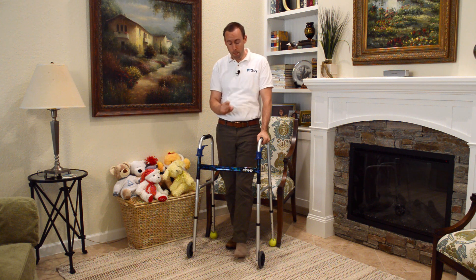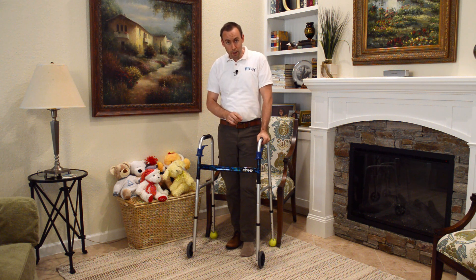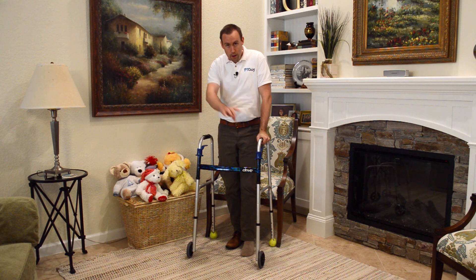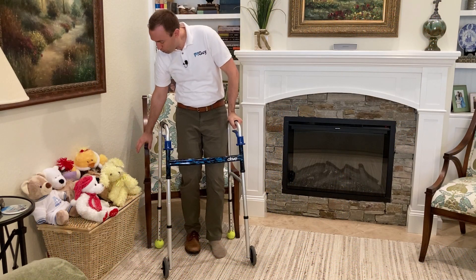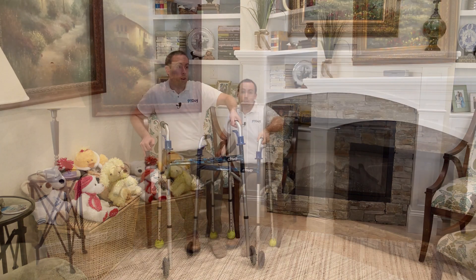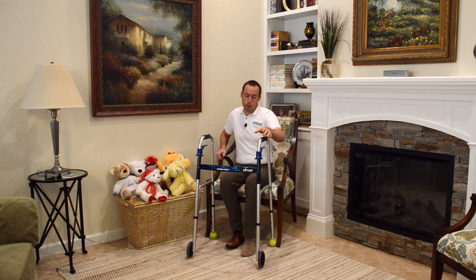Another important point: the same principle applies when sitting down. Keep your hand on the weaker leg side on the walker, then reach back to the chair first with your stronger arm, and then ease yourself down. That's how you do it going in reverse.